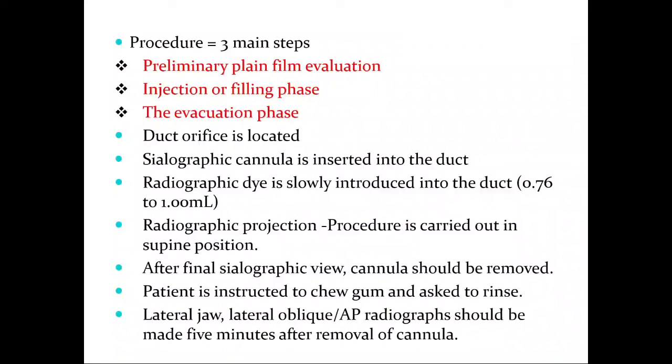Then the contrast is introduced into this cannula slowly in such a way that 0.75 to 1 ml of the contrast media is given, that is the oil based or the water soluble iodinated contrast is injected, and then the images are taken immediately after the injection is completed.